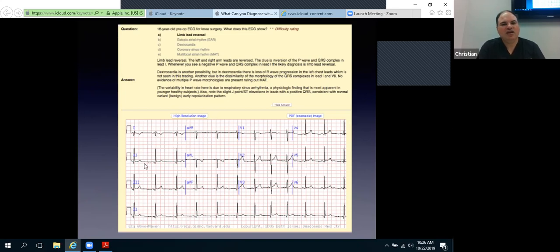Now, the way we get a sinus rhythm is by looking at upright P wave segments in leads 2, 3, and AVF. We don't see it here because this is the bad EKG, but this is basic and fundamental, and it has to be repeated, because in my practice I've been fooled before by somebody who comes in with a flutter, or a slow A flutter, slow A fib, where you're not seeing P waves in 2, 3, and AVF that are upright.